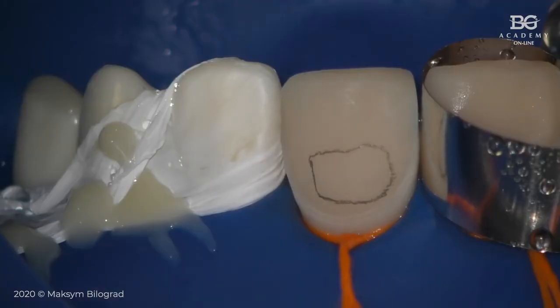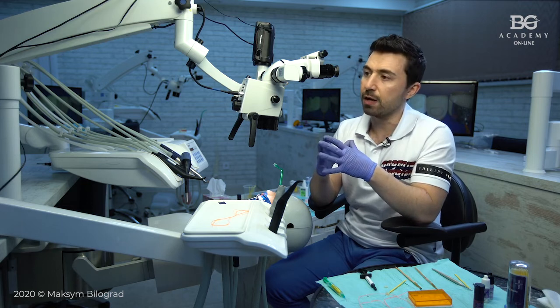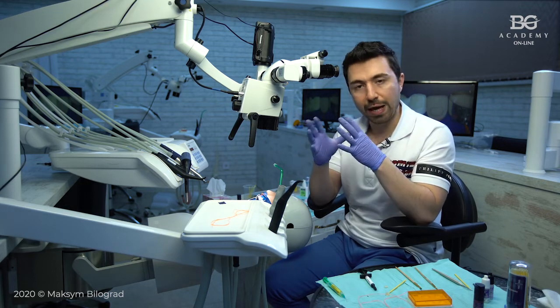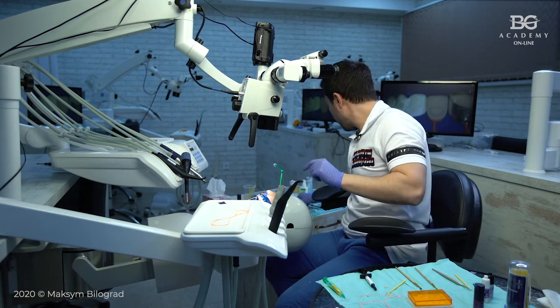So we're just going to the preparation of the tooth from the very beginning. Second scenario, again, forget about the one that I showed you before. So now, it will make a big difference if you use total etch adhesive system or self-etch adhesive system. If you use total etch adhesive system, you will etch enamel and you have to etch dentin. In this case, you have to etch dentin no longer than 15 seconds, okay? If you use self-etch system, you will etch only enamel and you will not etch dentin. This is the rule. So it will look like this.